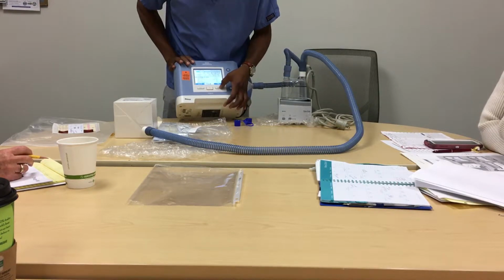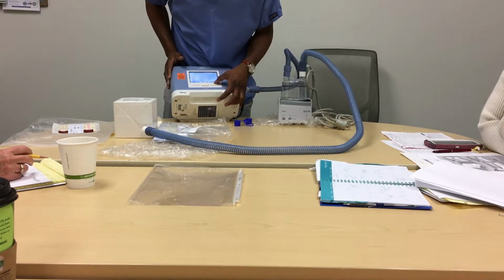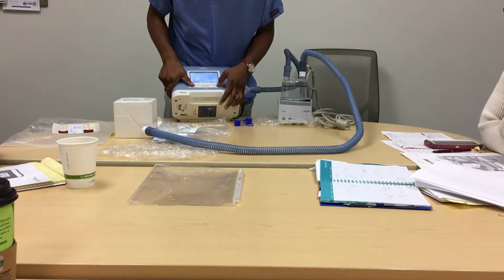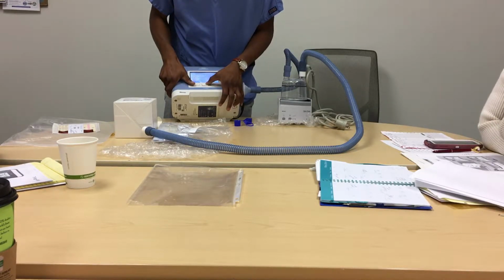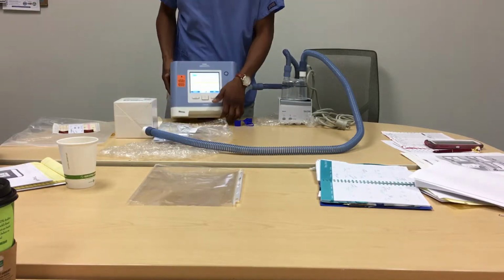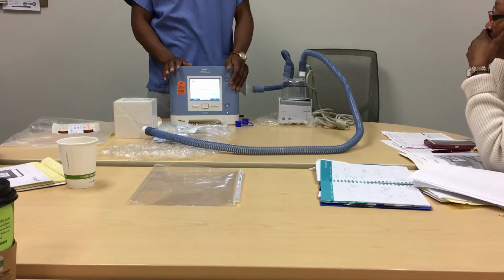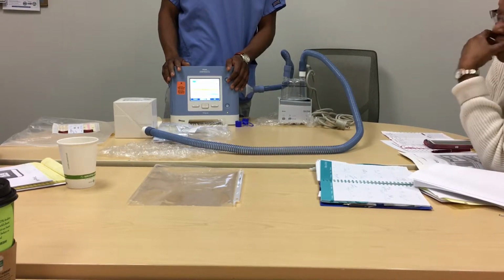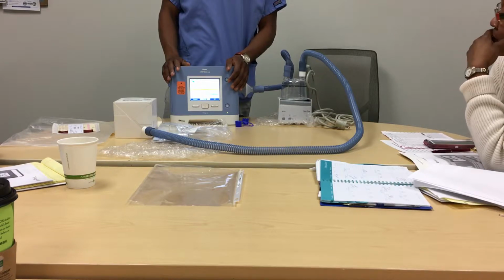Let's see. So it's like a bilevel. Yes, in essence. Here, let's cancel. Let's go back to the volume assured. Right, I was going to ask you, so you have a volume dial in too, right? A tidal volume dial in? Correct. It goes as high as 50, but that's like the extreme end. Oh, that's horrible. They're going to be in the ICU. That would pop them apart.